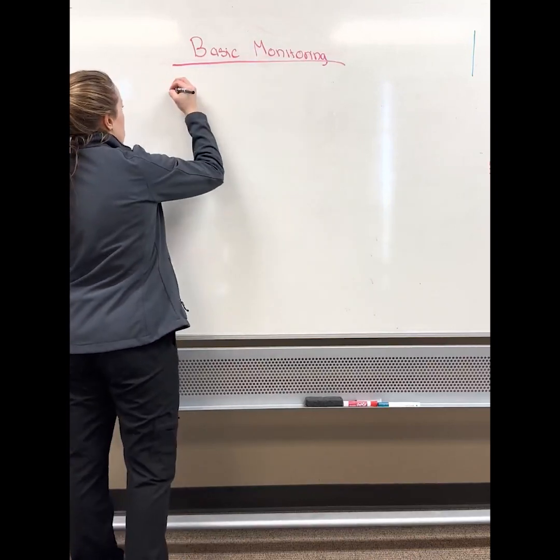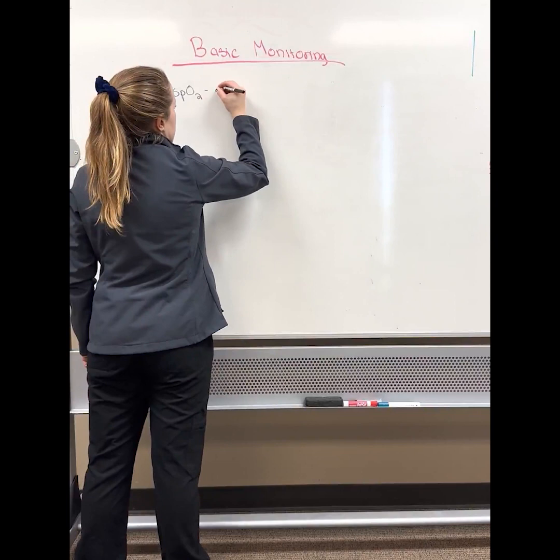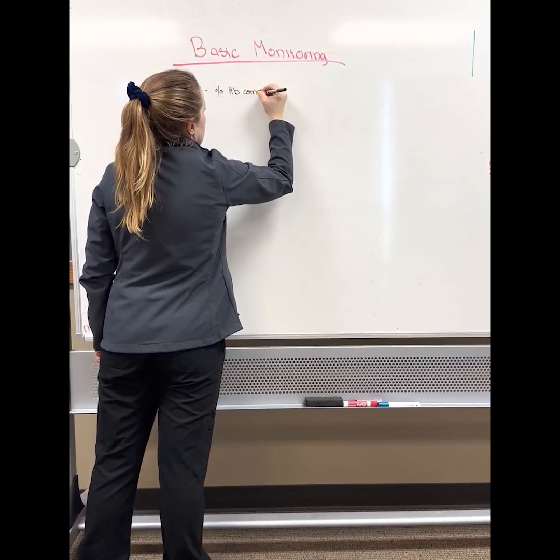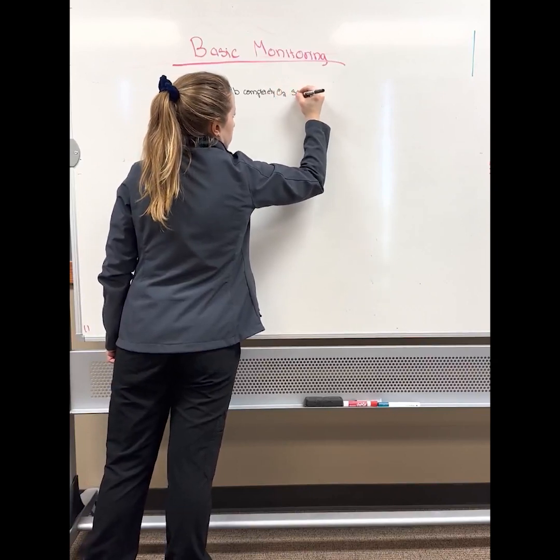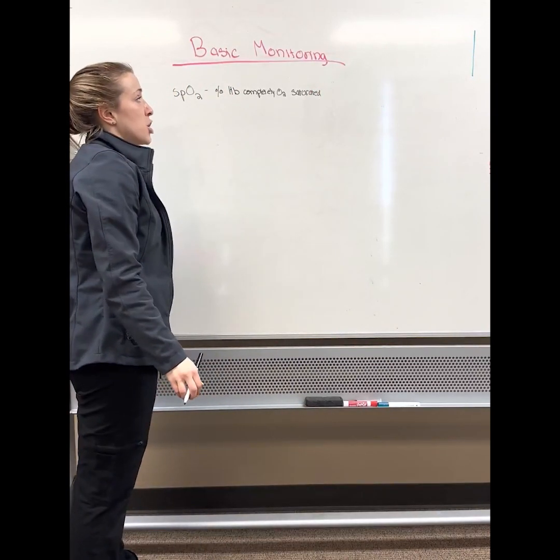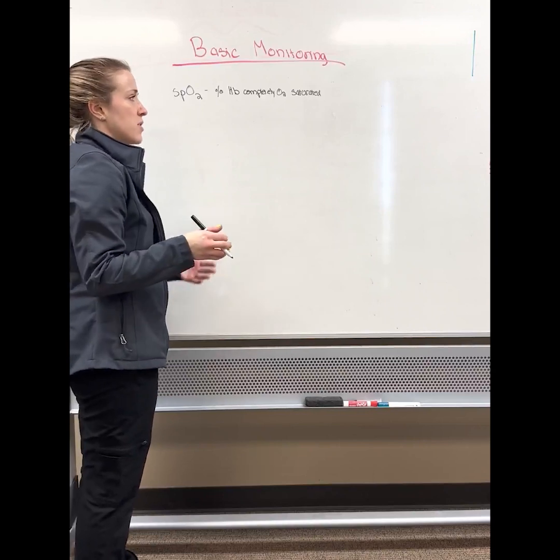The next piece of equipment I want to talk about is pulse oximetry, or SpO2. Pulse oximetry tells us the percentage of hemoglobin in the blood that is completely saturated with oxygen. Percentage hemoglobin, completely O2 saturated. So pulse oximetry gives us an indication about oxygenation status, and it also tells us the patient's heart rate, and can also tell us about the rhythm.